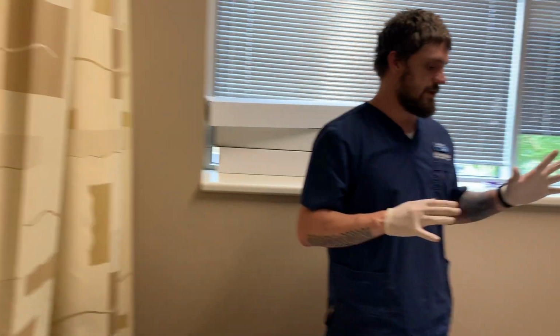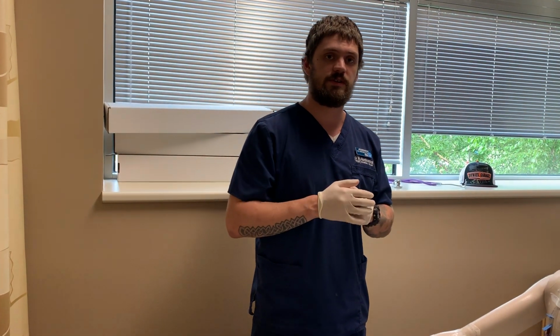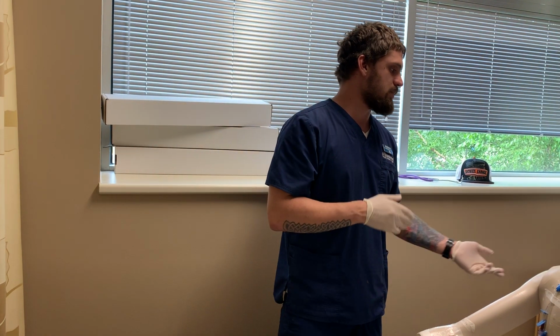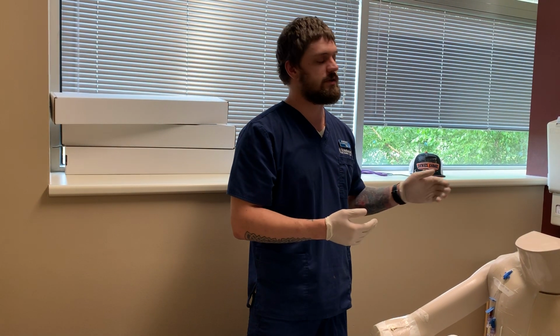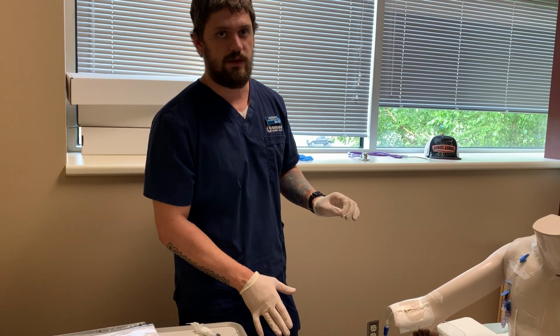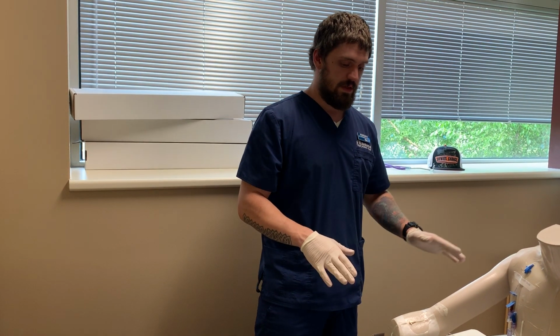Okay. So I noted in the drug book that this med does take about 20 minutes to reach peak effect. So I will be checking in on Ms. Doe to make sure that we are reaching a therapeutic drug level. And I will perhaps raise the head of the bed, or the head of the bed would have been raised, in order to help Ms. Doe breathe. We're going to lower the bed, because this can cause orthostatic hypotension and dizziness and things like that. Call light is within reach.